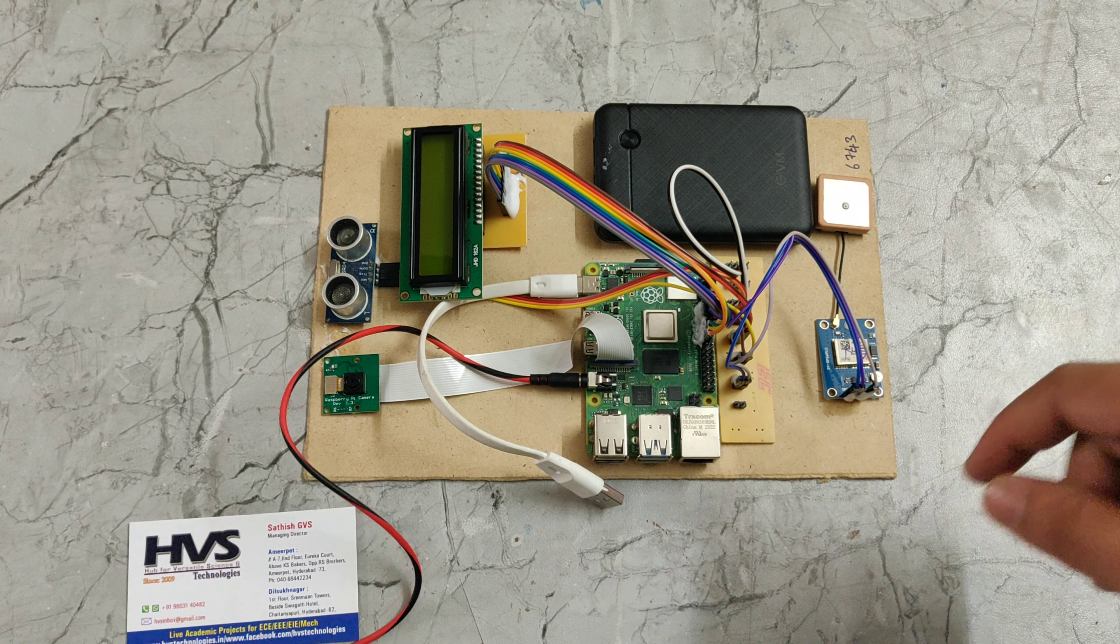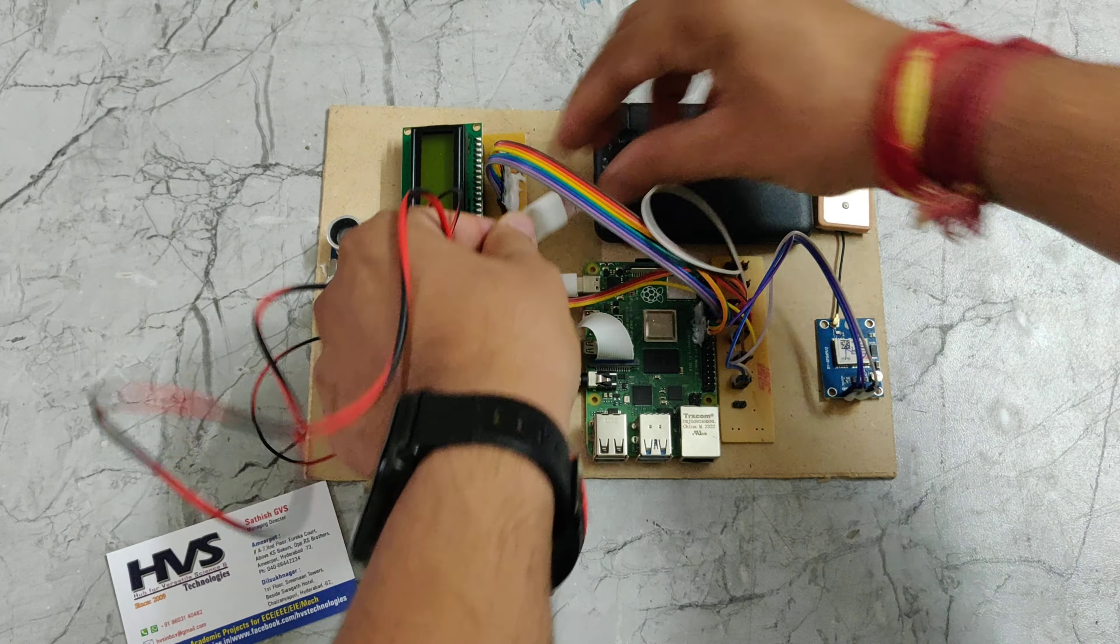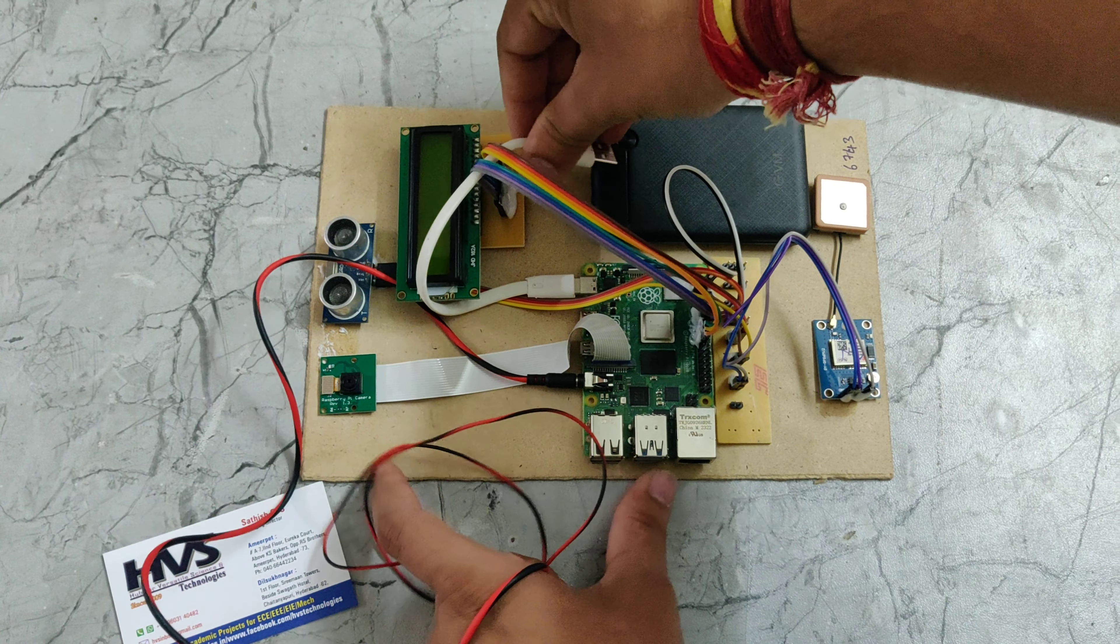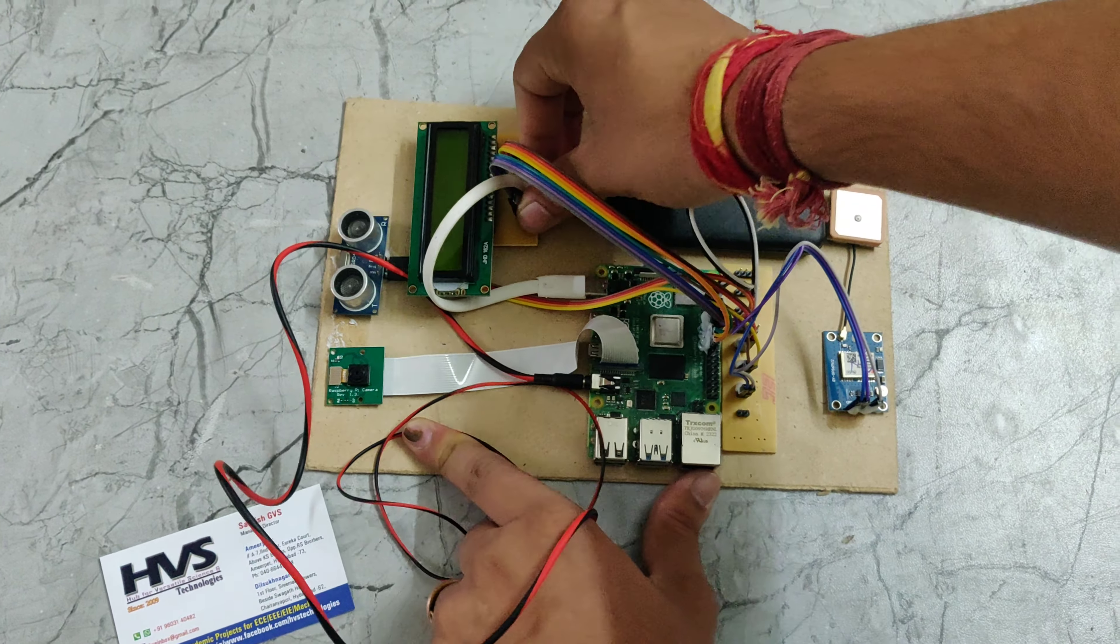Now we need to give the power supply using this power bank. So now I am giving the power supply.